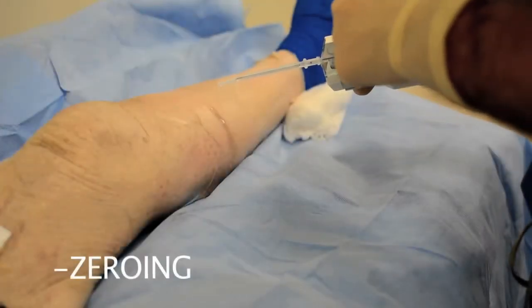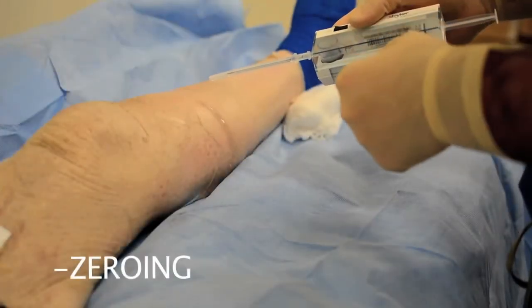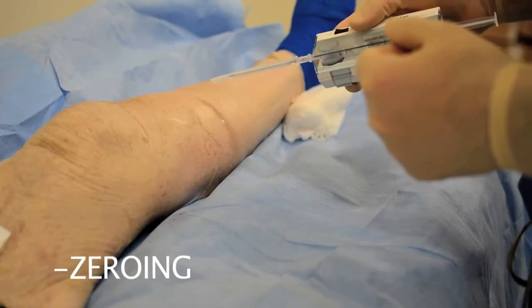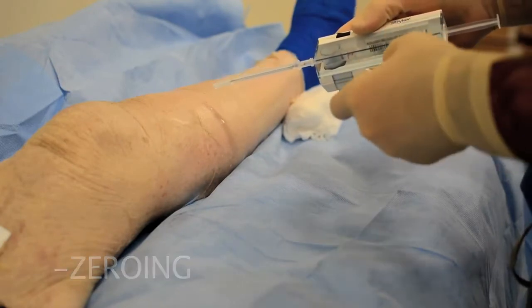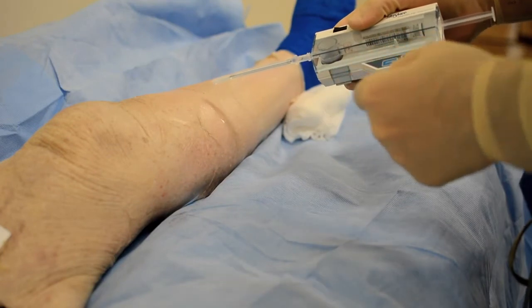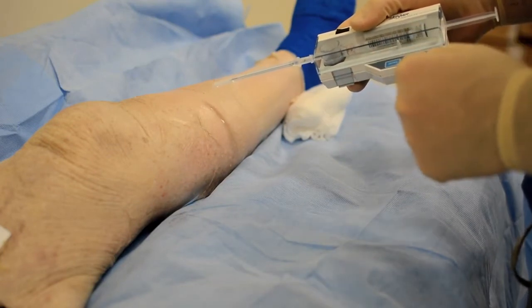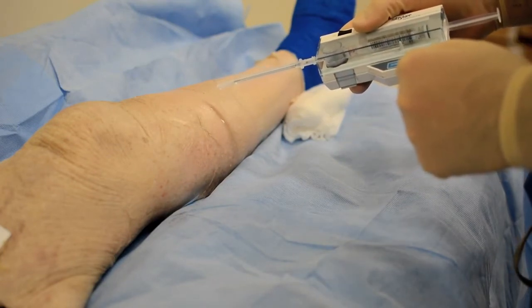The next step, with your device in the on position, you will zero at the angle of intended insertion, as done here. Verify in the monitor window that indeed the device is close to zero.